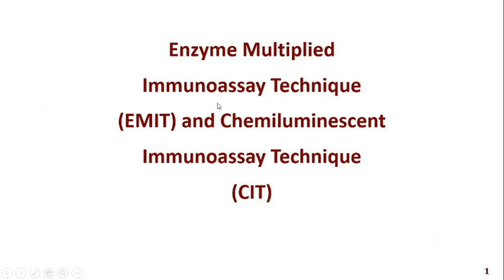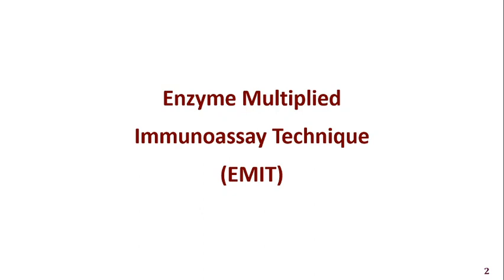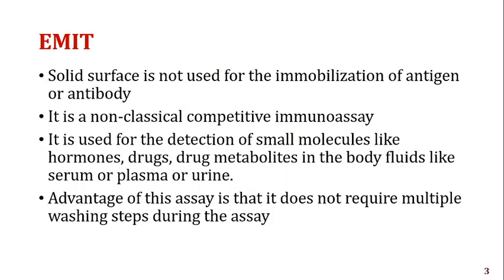I'm going to talk about enzyme multiplied immunoassay technique and chemiluminescent immunoassay technique in this video. First, I will take up enzyme multiplied immunoassay technique. It does not require a solid surface to immobilize the antigen or antibody. Second, this technique is a non-classical competitive immunoassay.